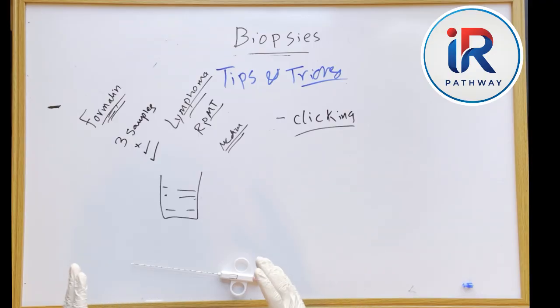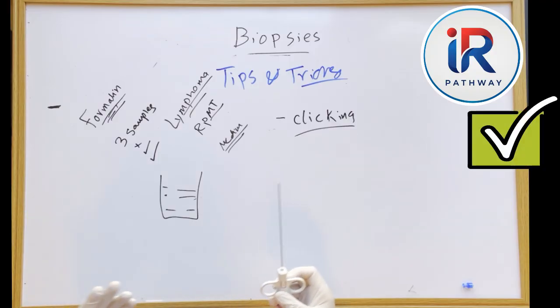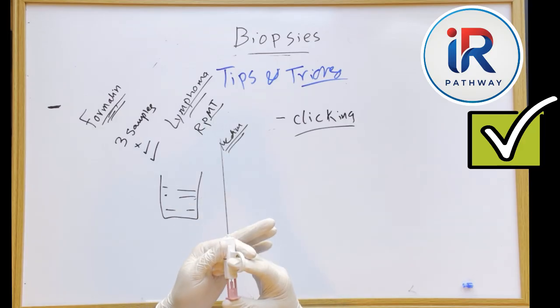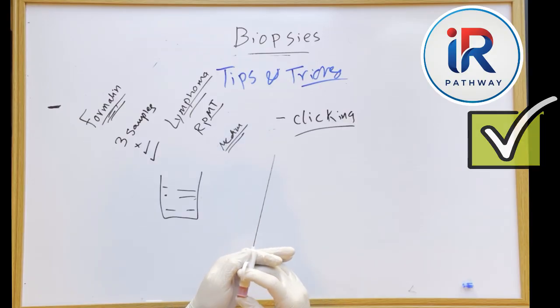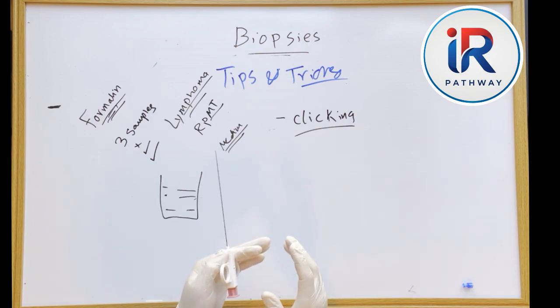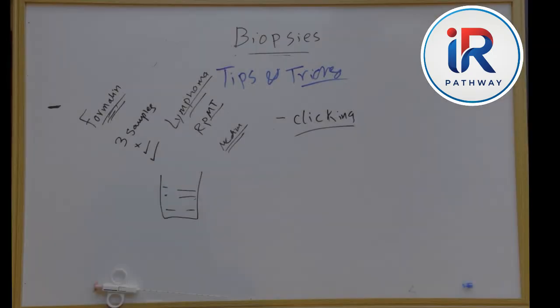So, it's very important to speak with the patient before you begin taking the biopsy. If the patient can tolerate seeing the needle, you may show it to him and explain that it makes a clicking sound during sampling and that the click is not painful. On the contrary, it indicates that we are in the right position and successfully obtaining the sample. But of course, if the patient is afraid of needles, it's not necessary to show him the needle itself. So it's very important to prepare your patients for the procedure.